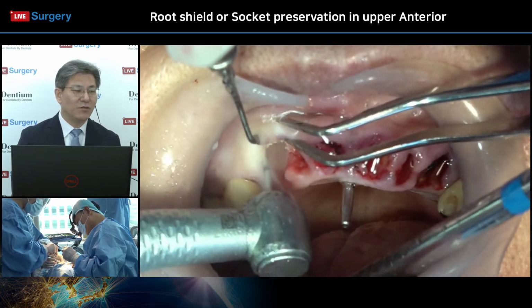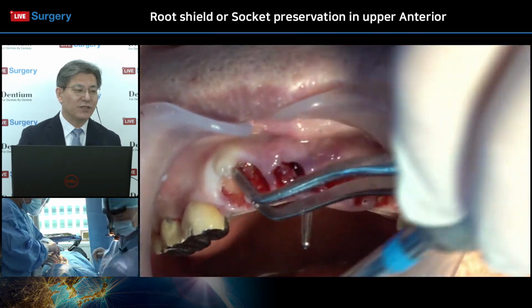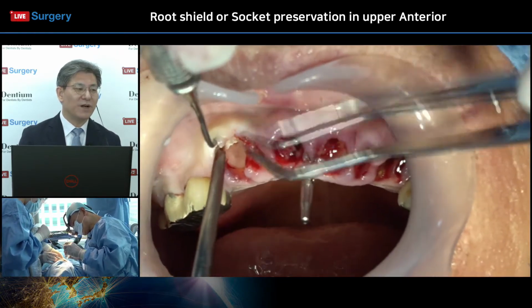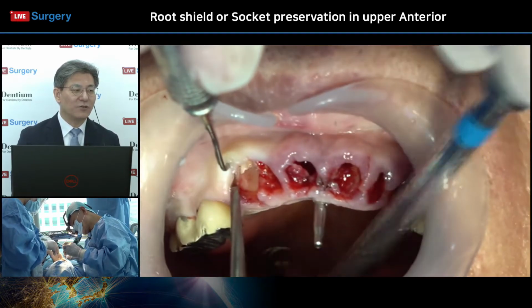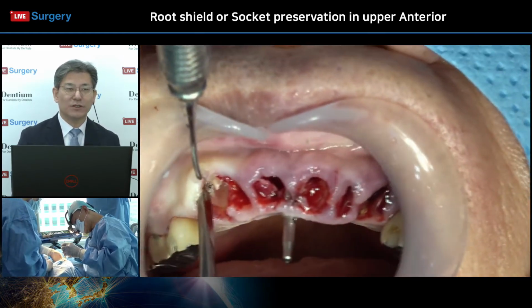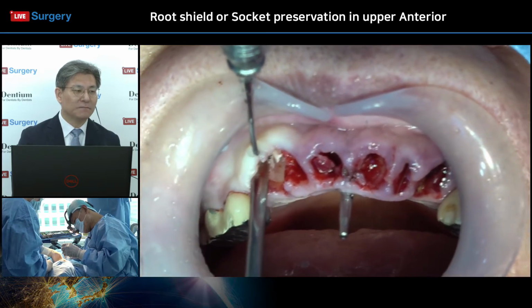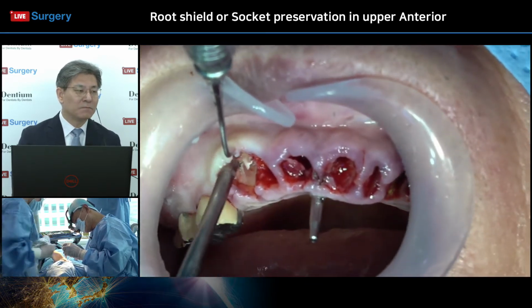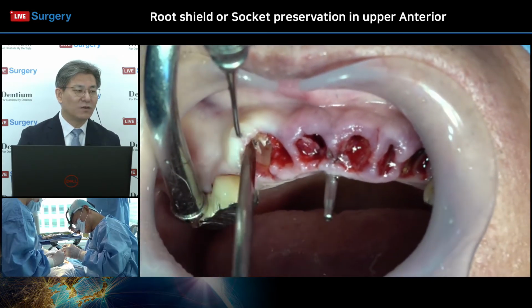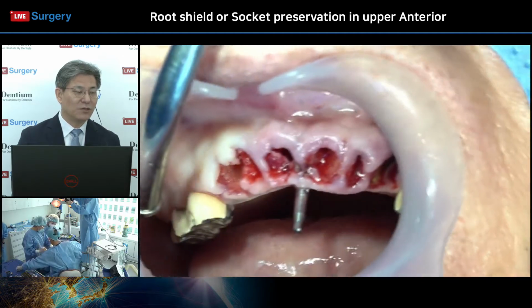Internal exposure means that after final restoration, we can sometimes see the remnant of the tooth fragment exposed through the soft tissues around the marginal portion. It is a complication of the socket shield technique. So sometimes we have to remove all the top portion of the root.